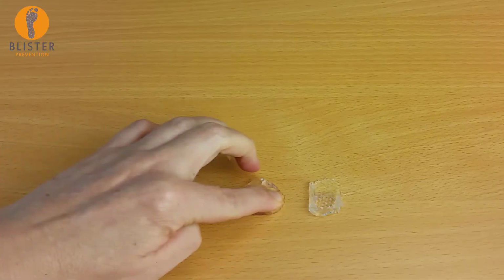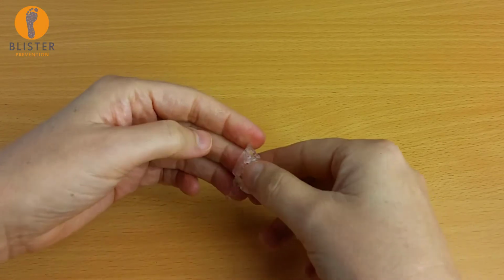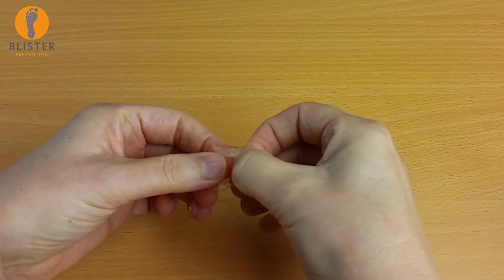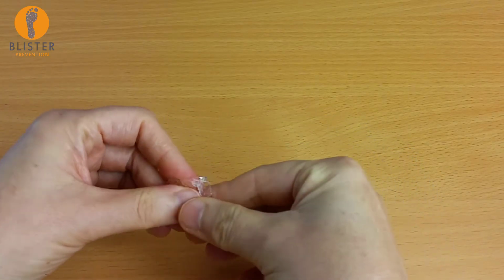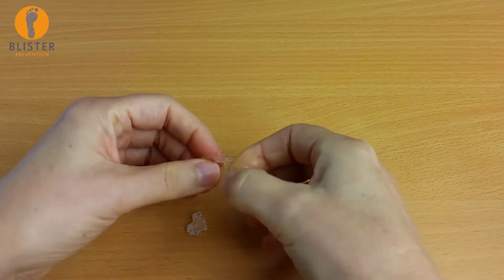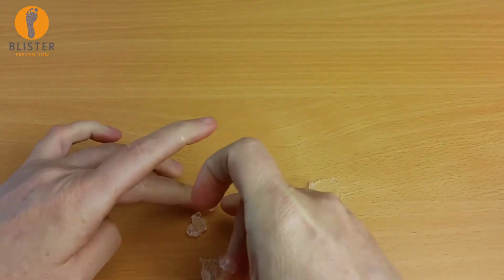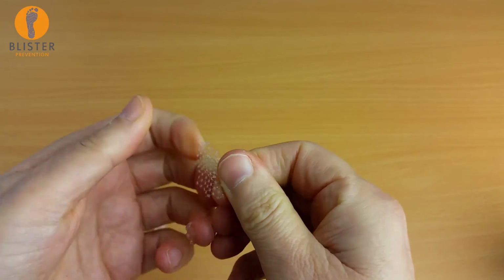Thirdly, the jelly wears through if there's a lot of pressure and movement applied to it. That's not so good when you're dealing with blisters on weight-bearing areas of your foot, like under the ball of the foot. I put it under my first MPJ and jogged on the spot, and there was no gel left where I needed it most when I checked after 10 minutes. The gel had worn through. When you look closely at the product, it's not that difficult to replicate this. You can move that gel away with moderate effort to reveal the plastic mesh underneath.